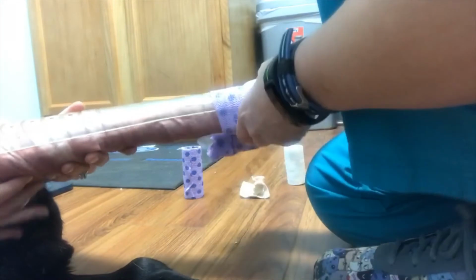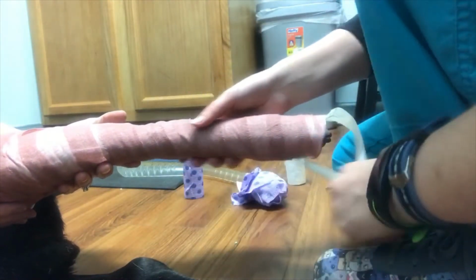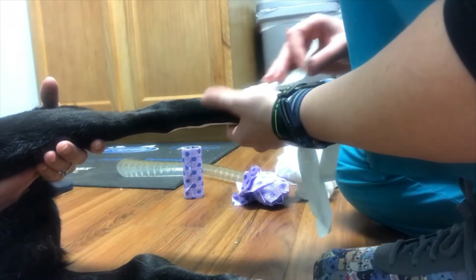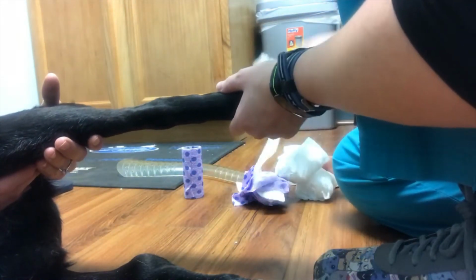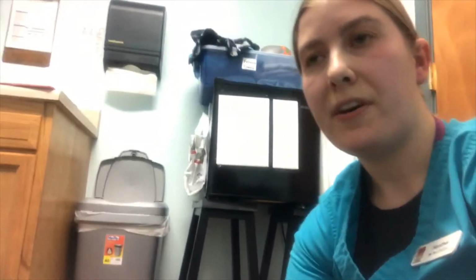Sometimes, depending on the condition of the bandage, if it's been on for a few days, whether it's gotten wet or dirty or anything, or even just having a bandage on for a few days, it's going to have some gunk on it regardless. Remove the splint there, and I'll pull the stirrups off, ever so gently. The worst part is removing the stirrups. Luckily, again, a fresh bandage hasn't stuck to the skin, but sometimes it will peel away the skin, and that would have to be addressed at the time. So that is how you would place and remove a modified Robert Jones bandage and splint.